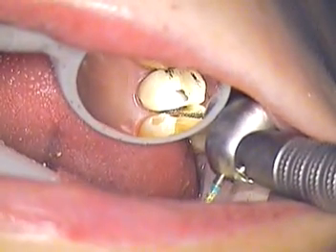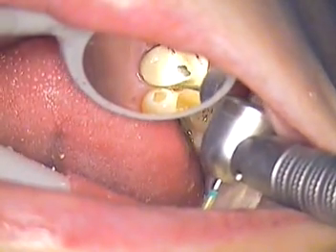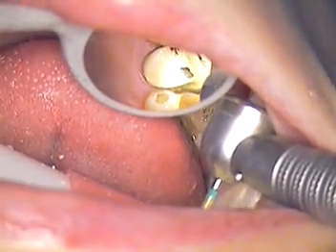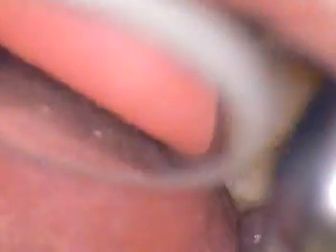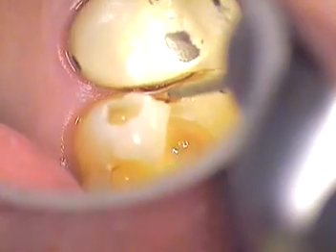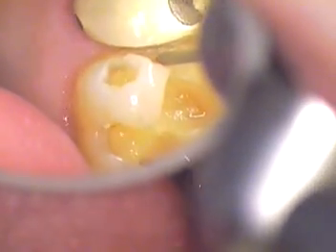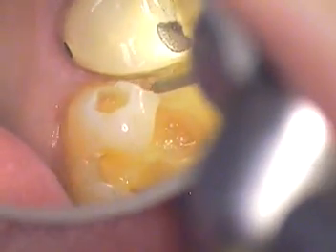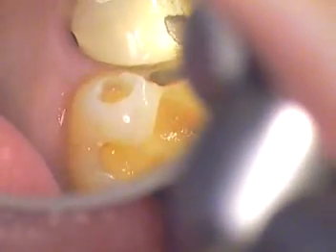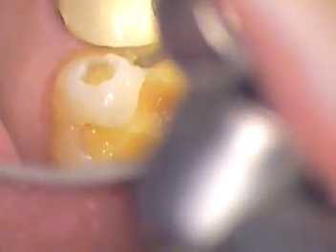Now I'm going to come into this mesial aspect and let's clean that up next. Not only does this have to be done properly, but also the contact of the adjacent tooth on an old crown needs to be polished properly. That is definitely one of the steps.